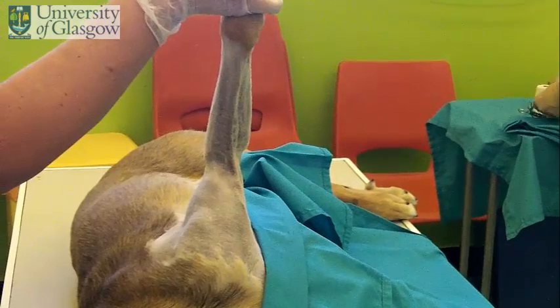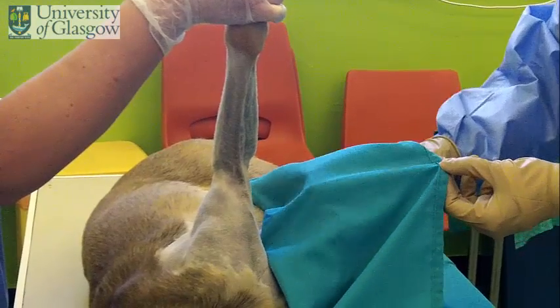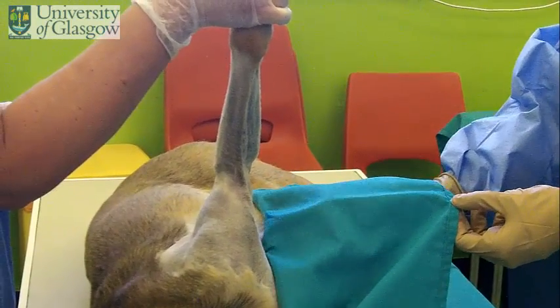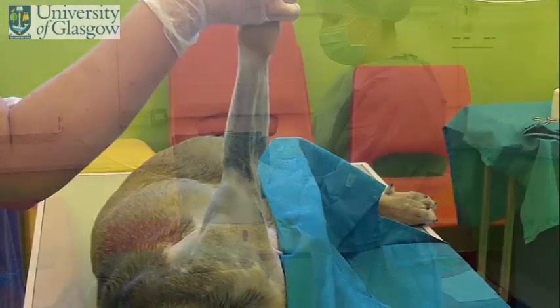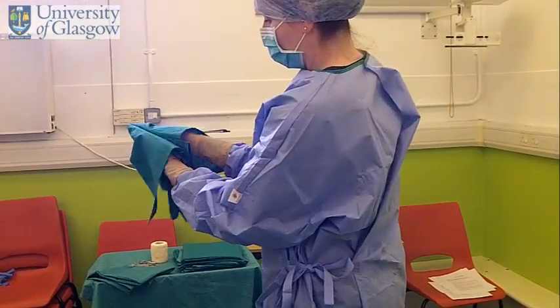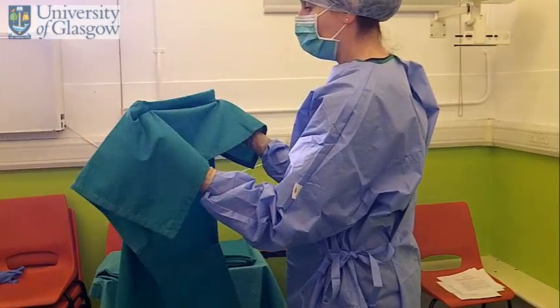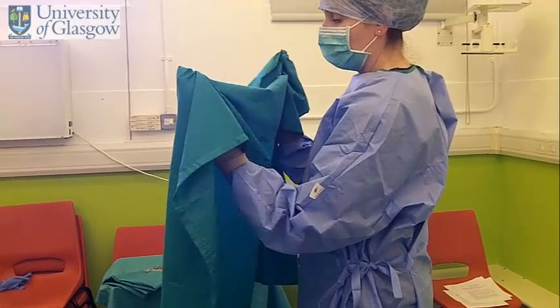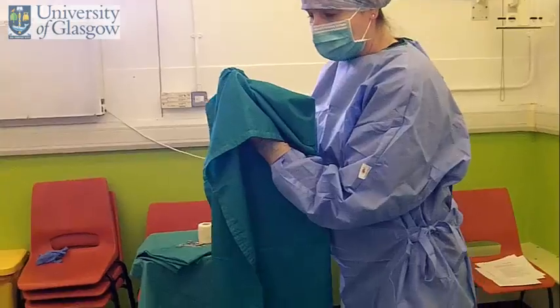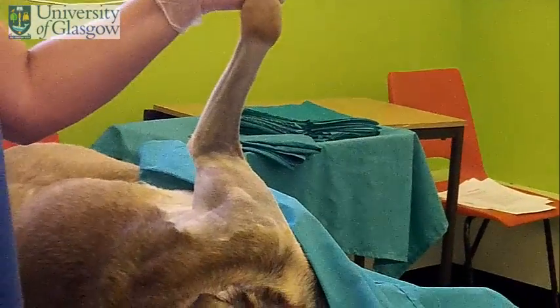Top one up, reach under your drape. Again, finding the one flap over each hand, you're going to pinch the corners, let the drape pull. Roll the drape so your hands are protected. Then because I'm going to walk around the front of the table, you want to hold the drape on itself to protect it. Making sure you're not coming in contact with the table, and you're going to find the drape.